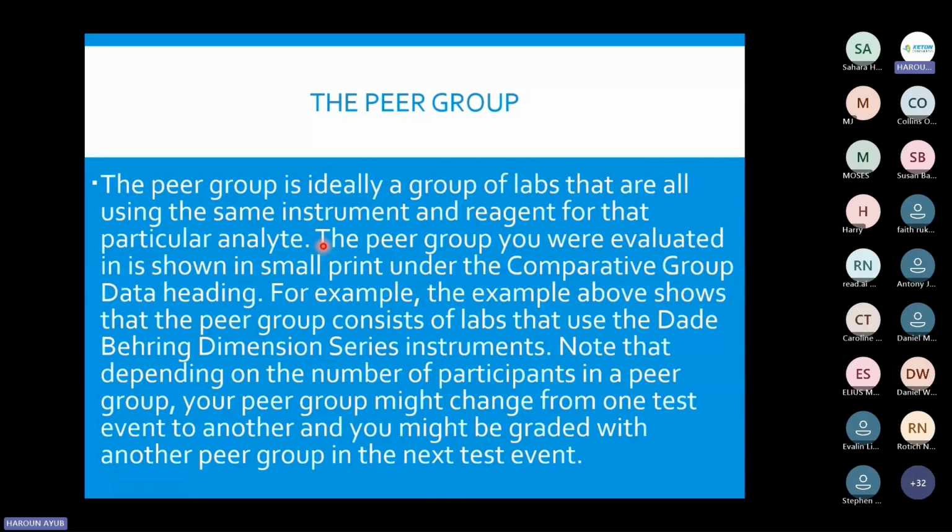You find that instruments using dry chemistry methods will have very varied results compared to wet chemistry methods using maybe IFCC. We'll have other analytes that use the DGKC method or IFCC. These are 2 different methods, and they will get very different results. So it is very important that we also group you according to the method you are using.